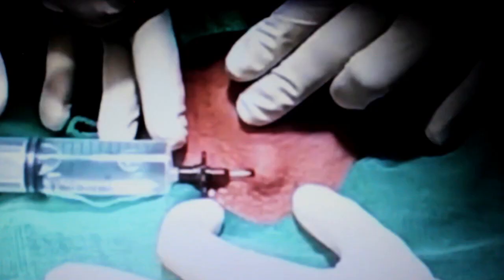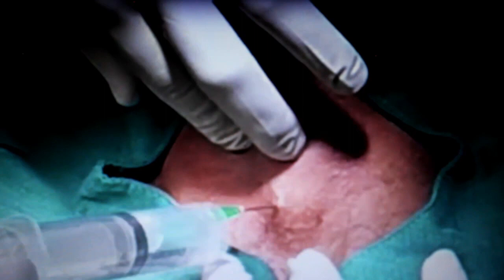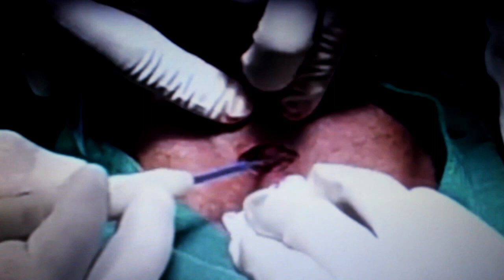Before starting the incision, give local anesthesia, that is 1% lidocaine with 1 in 1 lakh epinephrine, in a diamond shaped fashion between the lower border of cricoid and the suprasternal notch, and a vertical or a horizontal incision can be done. This is a horizontal incision between the anterior border of two sternocleidomastoid muscles, midway between the cricoid cartilage and the sternal notch. The scar is less with this, but the chance of bleeding is more.